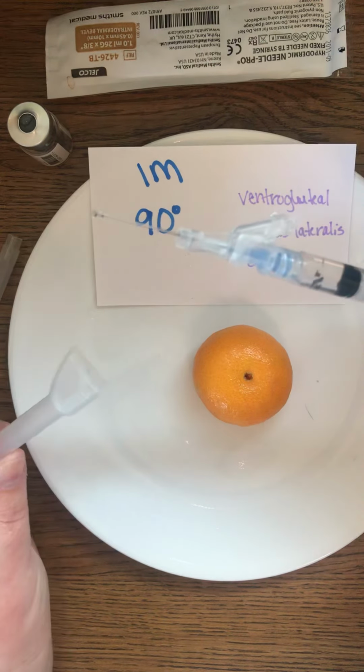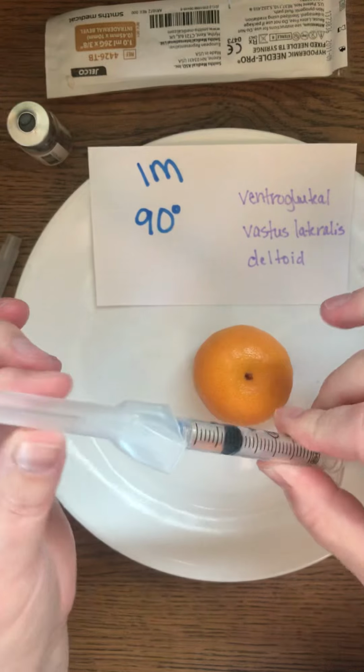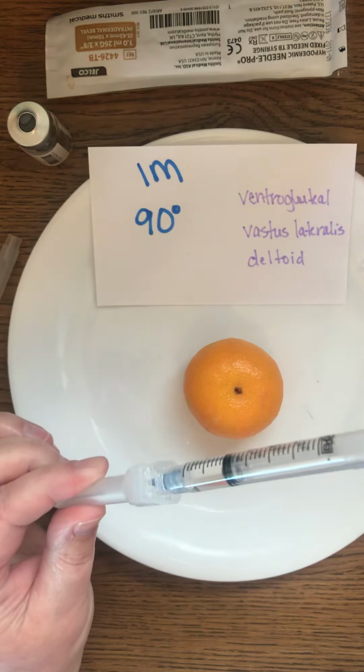Same thing as before, if we're going to use our needle right away. Otherwise, there it goes, like this, and I could cap it. But we're going to just draw this right up at the bedside. We've already cleaned our skin, and then we're going to be ready to go.